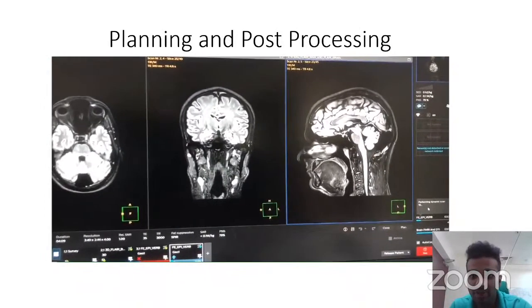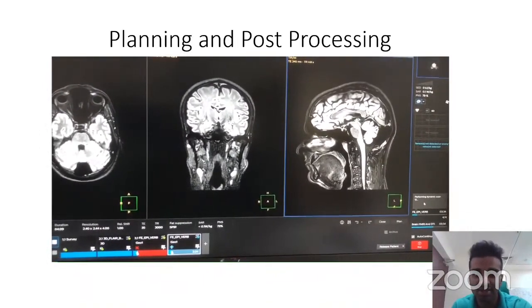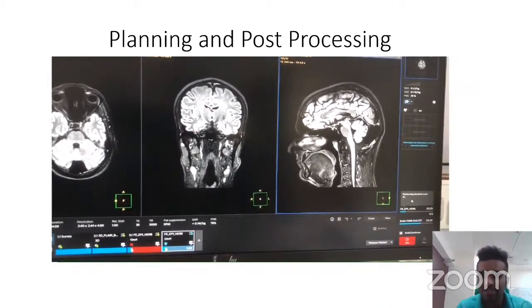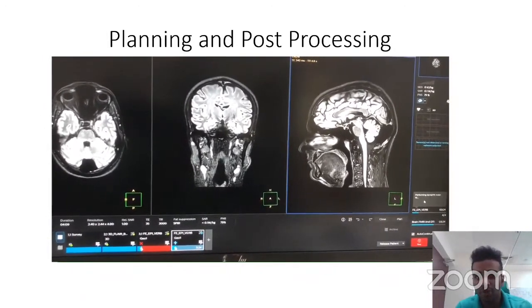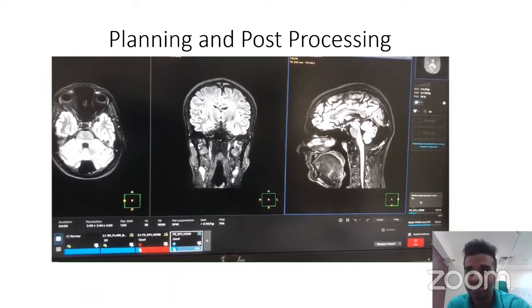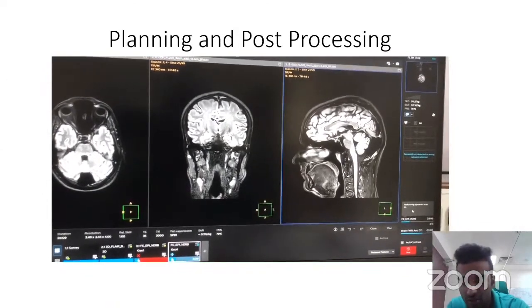Okay, now the dynamic level has started, so I'm giving the task. See, I'm giving him random words like mother, father, hospital, etc. So he has to think of that word. Vehicle. When he thinks of that word, the region which controls that activity is getting more oxygenated blood. That is ultimately what gives us the signal, the activation in yellowish color. Hospital. We'll see that. See, 20 dynamics got over.